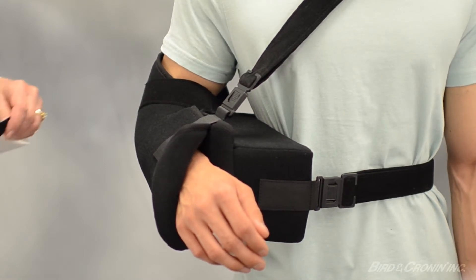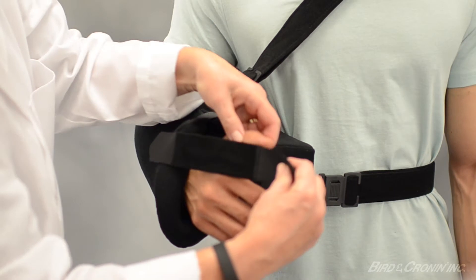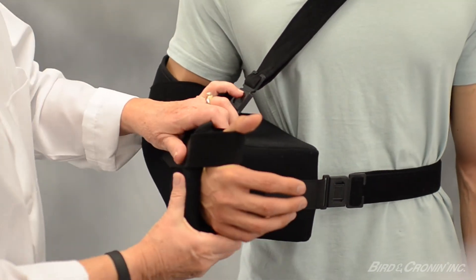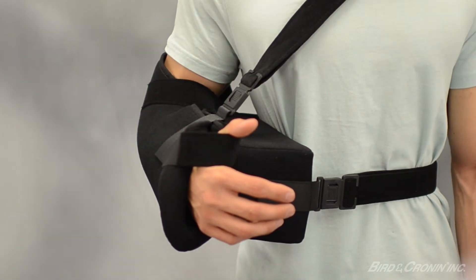The second 1.5 inch hook strap can be used as a thumb strap. Finally, you may reattach the exercise ball to the outside of the sling.